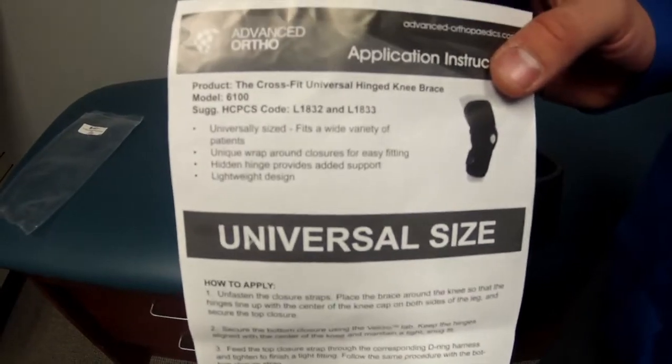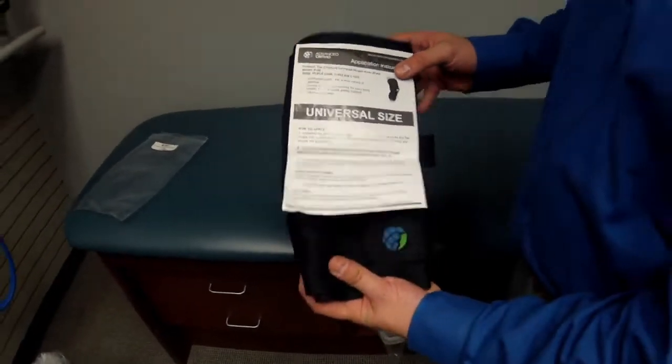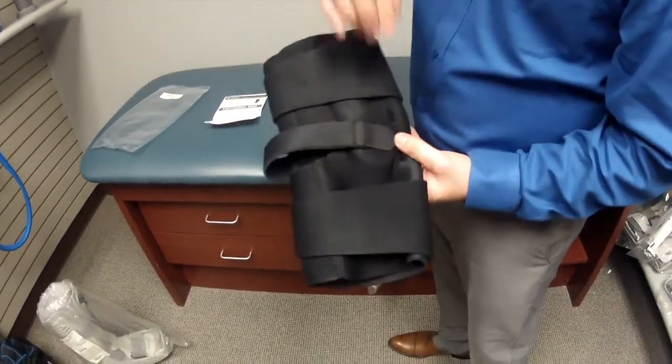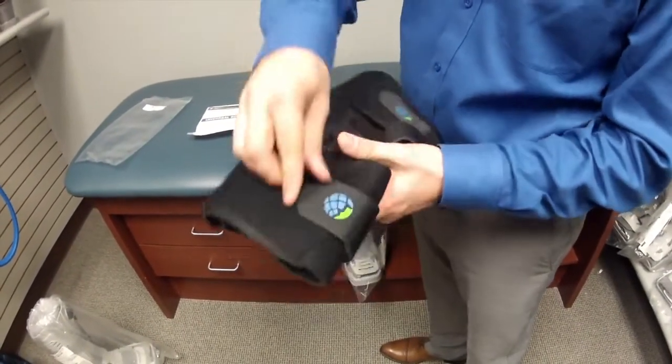This is the Advanced Orthopedics L1832 and L1820 Universal Wraparound Knee Brace. Today we're going to show you the L1832 version of this brace.